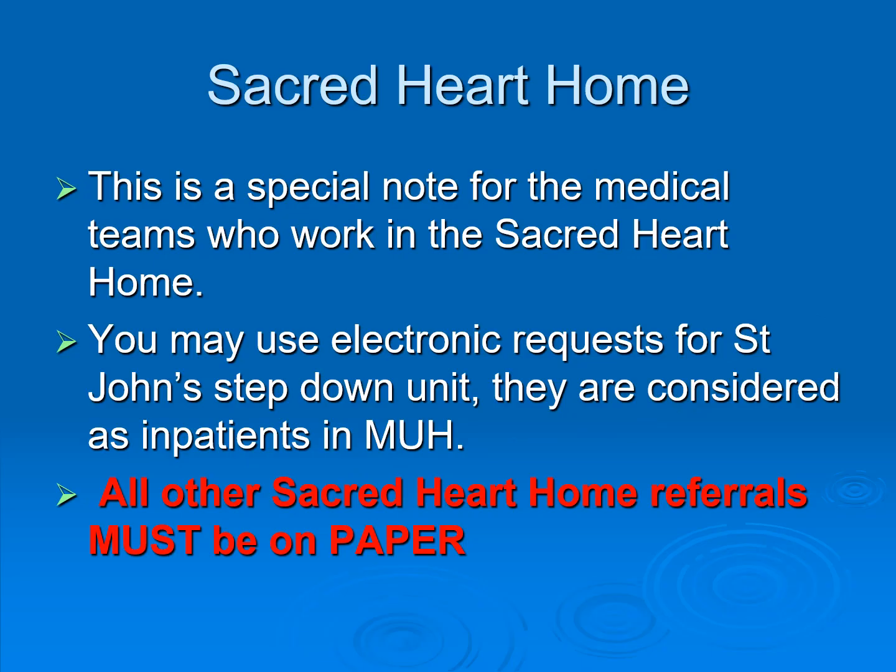This is a special note for the medical teams who work in the Sacred Heart Home. You may use electronic requests for St John's step-down unit. They are considered as inpatients in Mayo University Hospital. All other Sacred Heart Home referrals must be on paper.